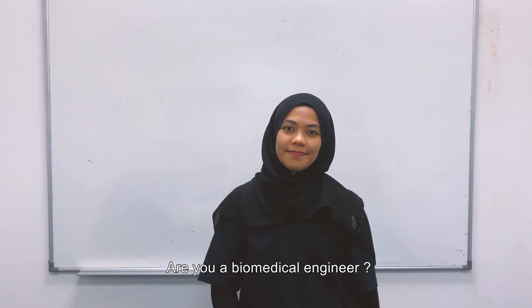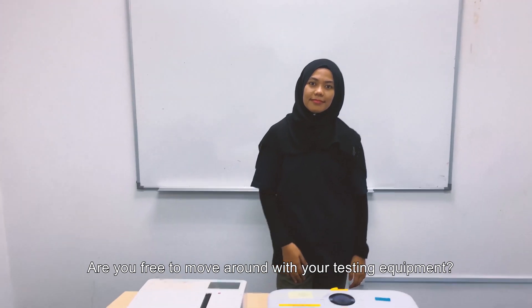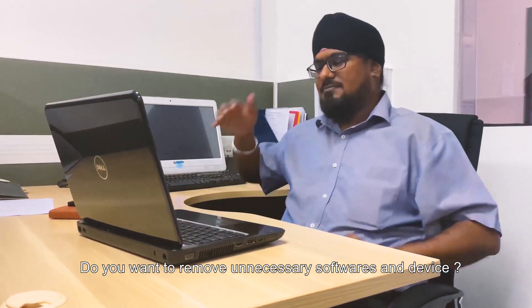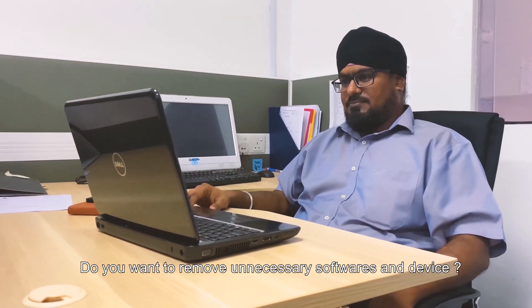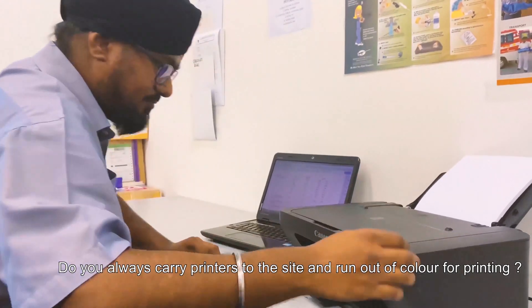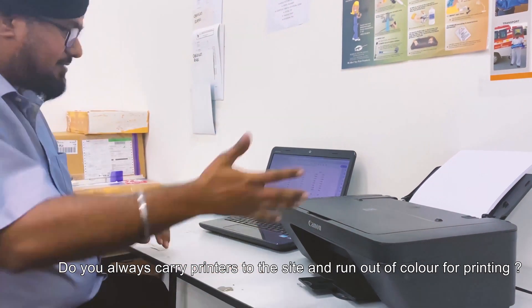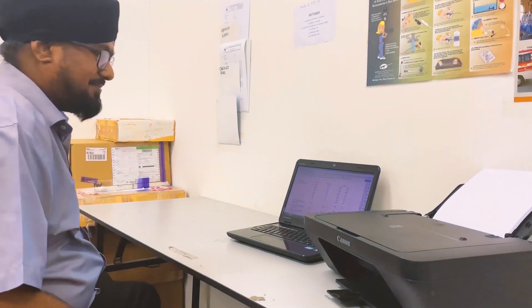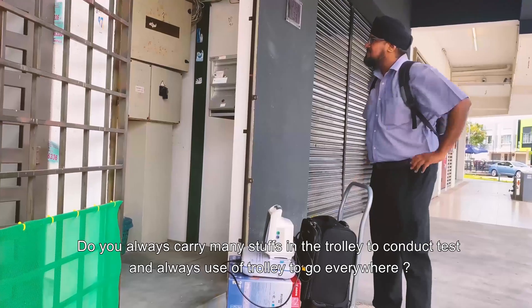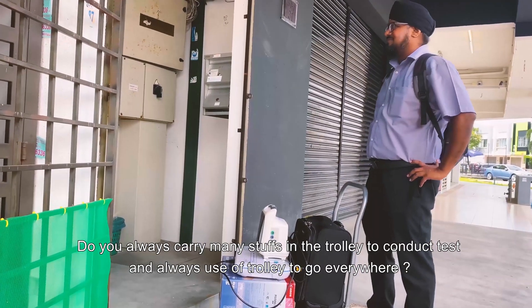Are you a biomedical engineer? Are you free to move around with your testing equipment? Do you want to remove unnecessary software and devices? Do you always carry a printer to the site and run out of color for printing? Do you always carry many things in the trolley to conduct tests and go everywhere with it?